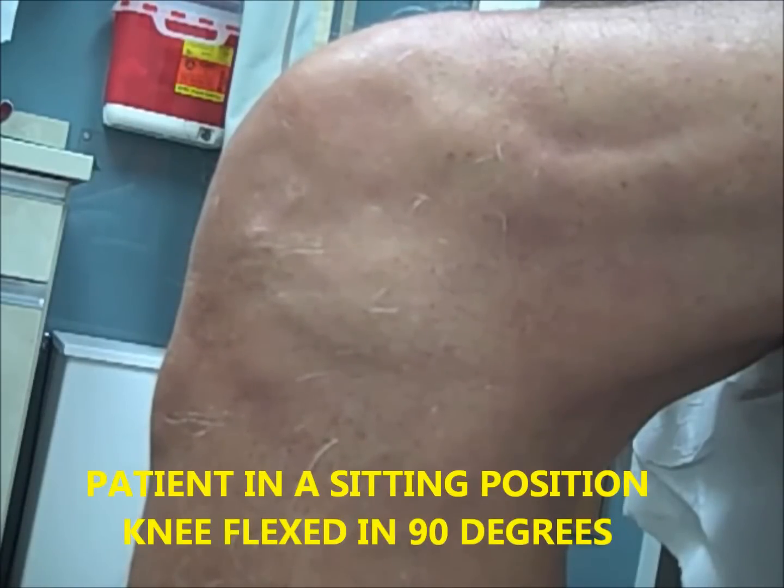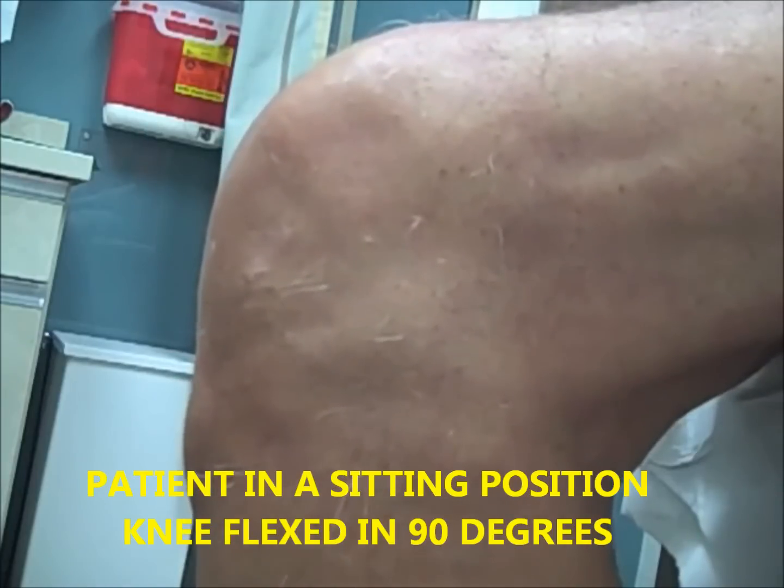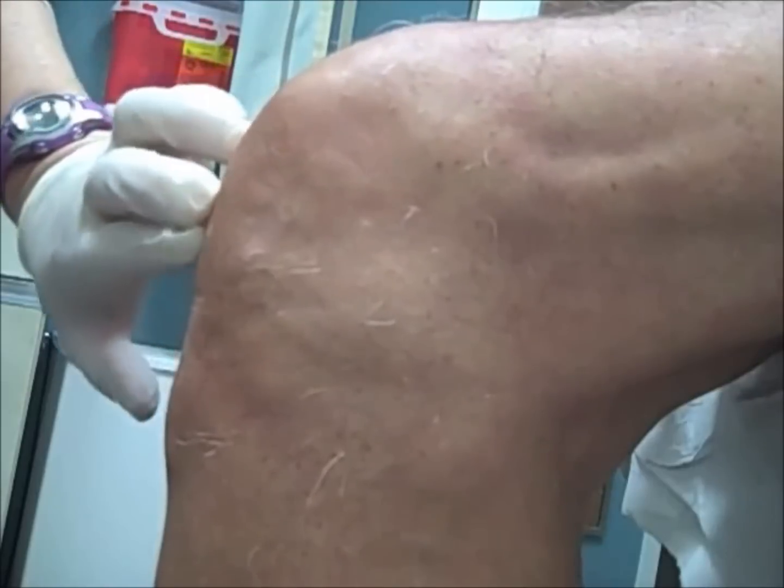We're going to be demonstrating a lateral infrapatellar approach with the patient in a seated position and the knee flexed to 90 degrees. At this point we'll identify the important landmarks for the injection and mark the injection site.